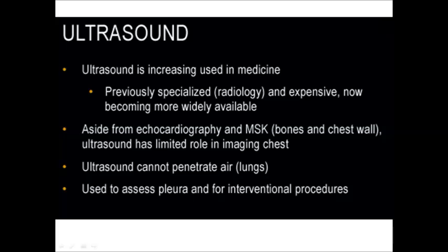Ultrasound has a limited role in imaging of lung because it cannot penetrate air, so it cannot give us images of lungs, but it's very useful in assessing the pleura and for interventional procedures.